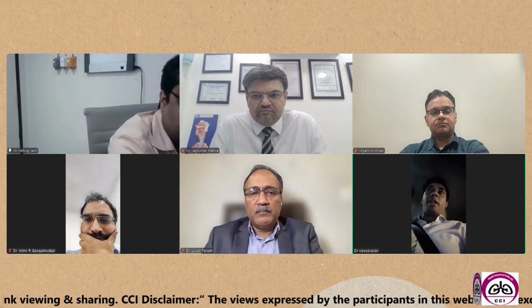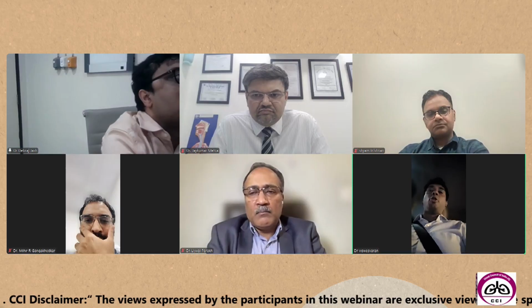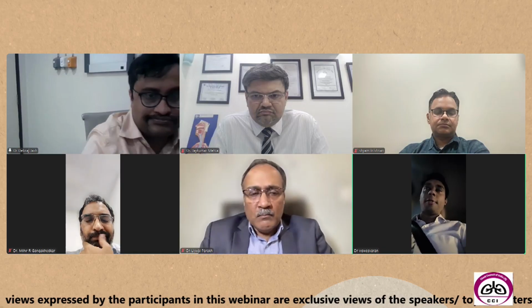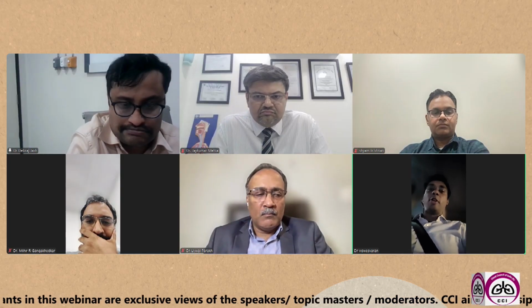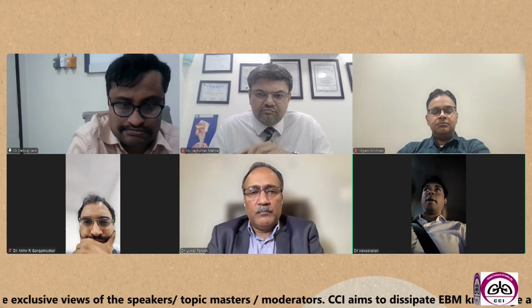So I think again, it ended up in a diplomatic answer, but that is the genuine thing. You don't have an advantage of one scope over the other. It entirely depends upon your comfort, and the yield entirely doesn't depend upon the scope. It depends upon the person and the level of competence he or she has. So I don't think just because somebody is doing procedures in one scope, it means that you have to purchase the same scope. If you are a very skilled person, you can get the similar yield, you can target the same set of lymph nodes with both the scopes.